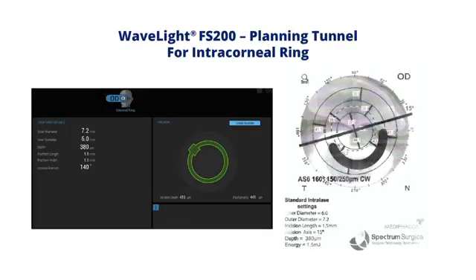So we bring our planning software up with this in position. We utilize either the suggested manufacturer's data. So we've got inner tunnel diameter, outer tunnel diameter. We've got a little access, which is that rectangular portion of the ring, and that will be our incision and pocket, which allows us to enter the cornea to place the ring. That doesn't have to be aligned with the axis of the ring. You can move it back a little bit from where the ring is going to position itself so that you've got more corneal seal to isolate the ring.